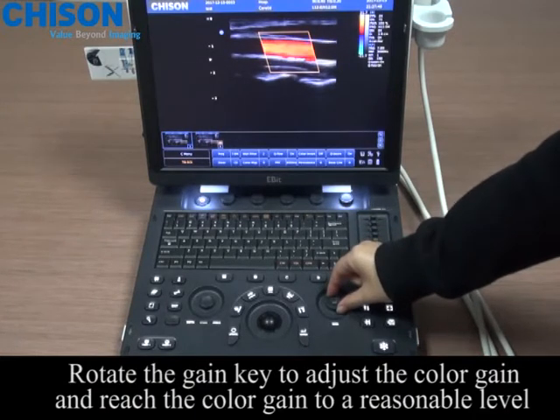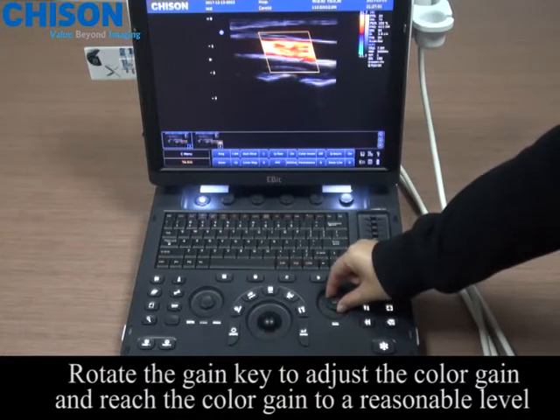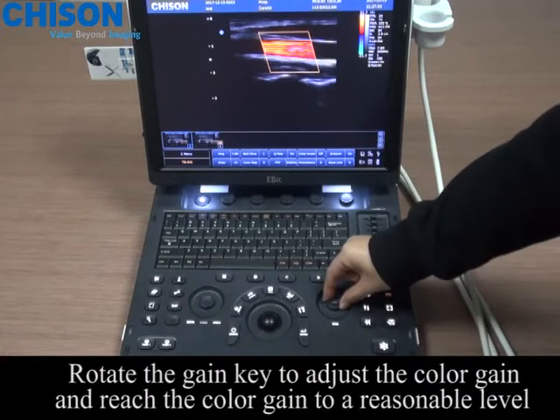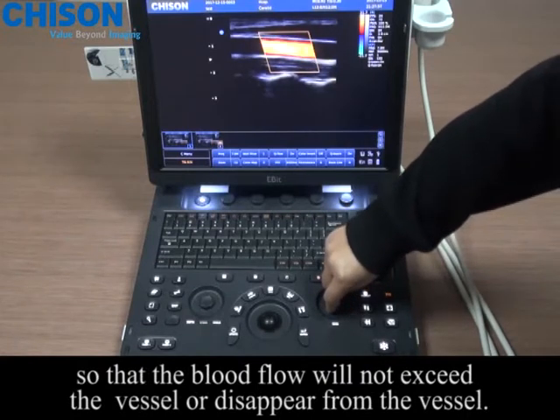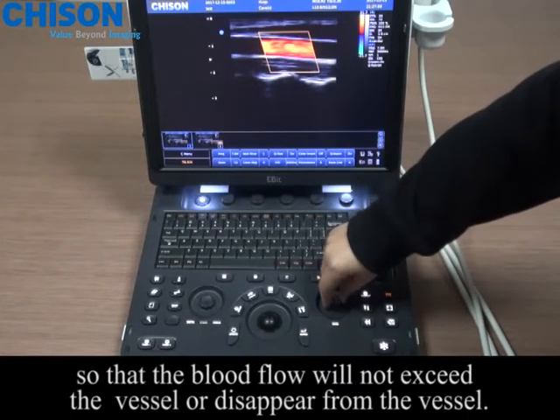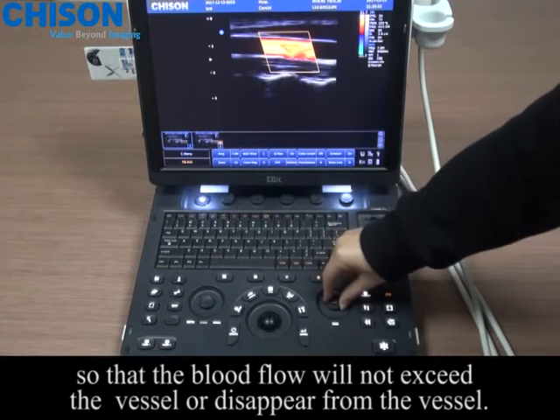Rotate the gain key to adjust the color gain and reach the color gain to a reasonable level, so that the blood flow will not exceed the vessel or disappear from the vessel.